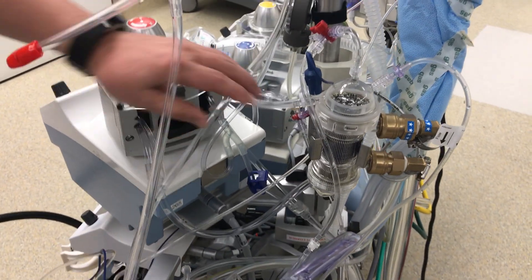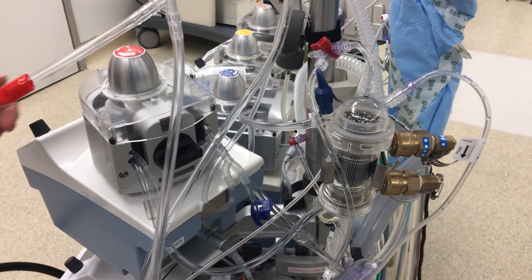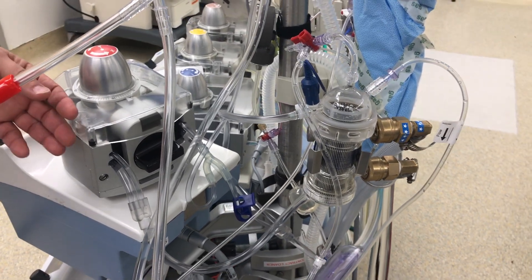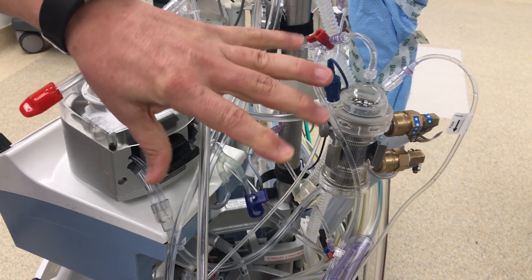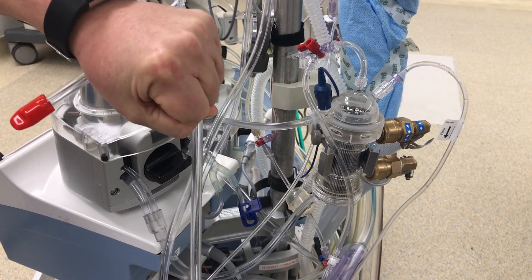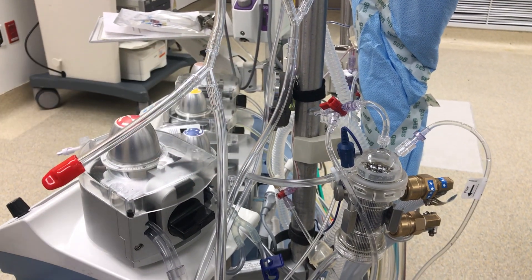There's a number of other tubes, and this here is the cardioplegia system. From the Latin cardio, heart, and plegia, to paralyze — this is how we're going to stop the heart, because it's easier to sew on something that's quiet and not moving than something that's trying to beat at 60 beats per minute.